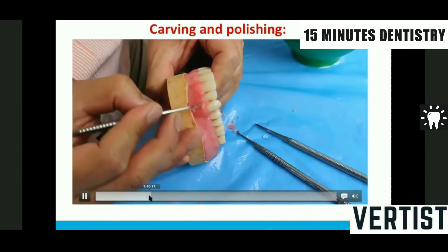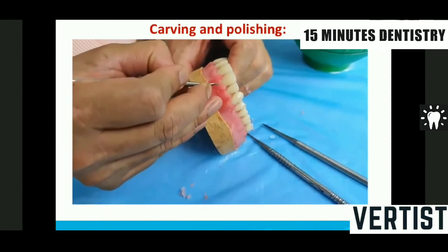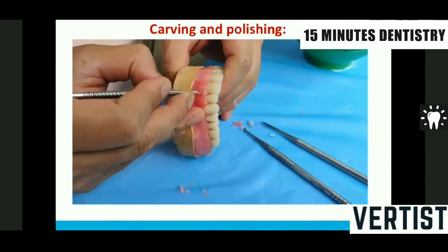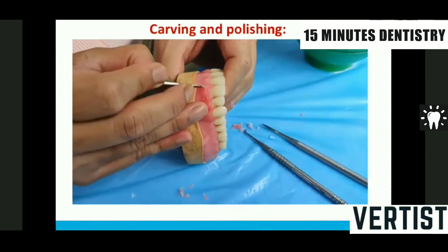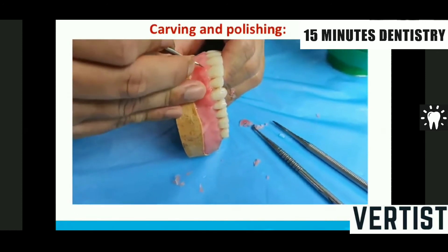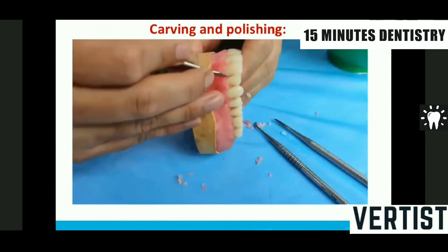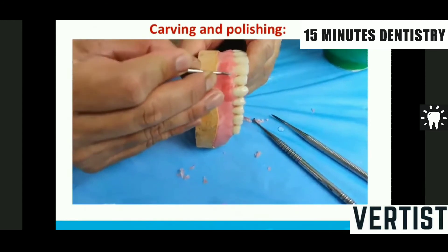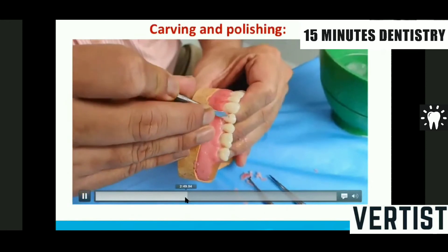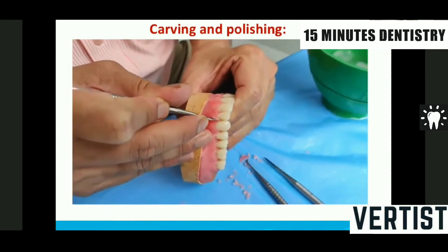Now I am removing the excess wax from the labial surface, then I carve out the free gingival margin — approximately one to one and a half millimeters below the gingiva. After carving all the marginal gingiva, I remove wax from the interdental area to make it slightly concave. I don't want any bulk in the interdental zone.